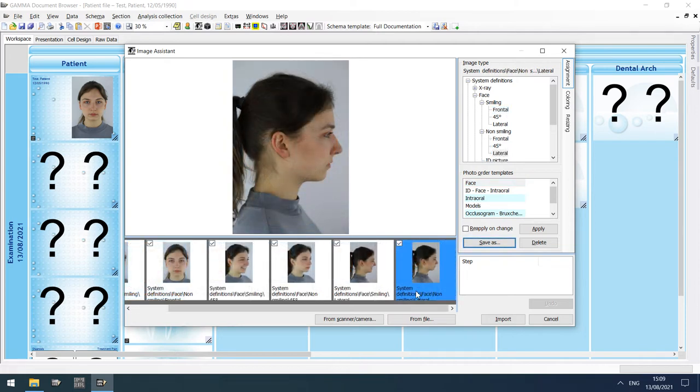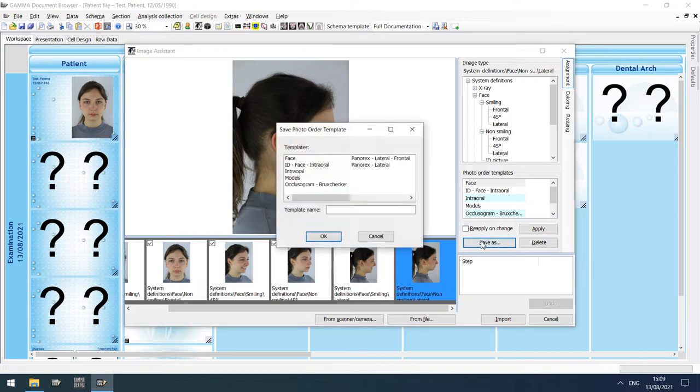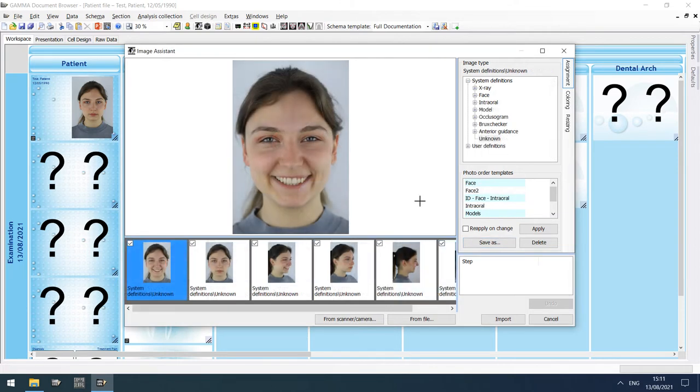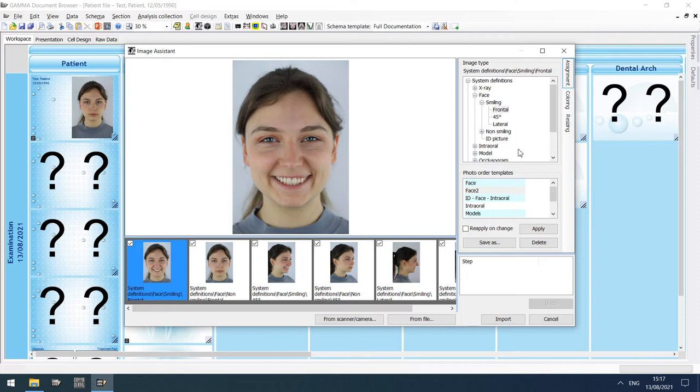If you find that the sequence of image types is the same for every patient case, you can save it as a photo order template to simplify the assignment in the future. To apply a previously saved template, simply select it in the list and click Apply. The image assistant also provides basic image editing capabilities.